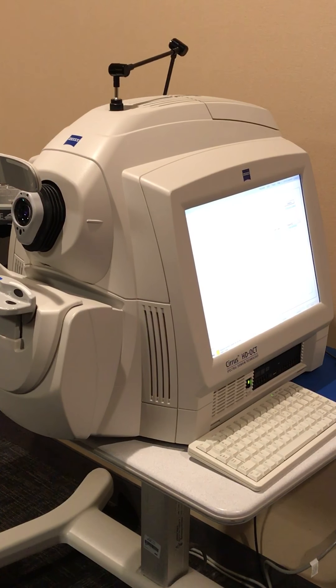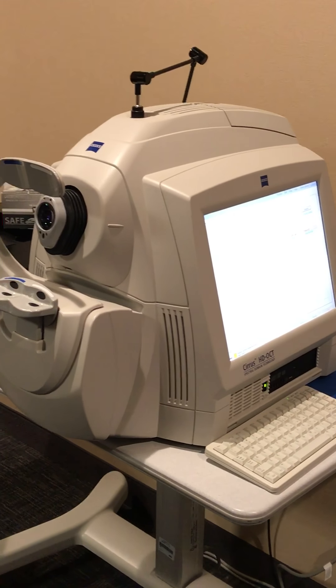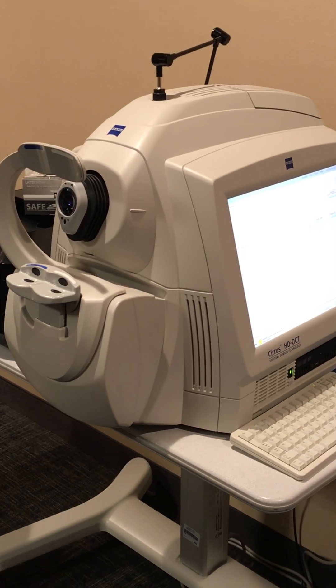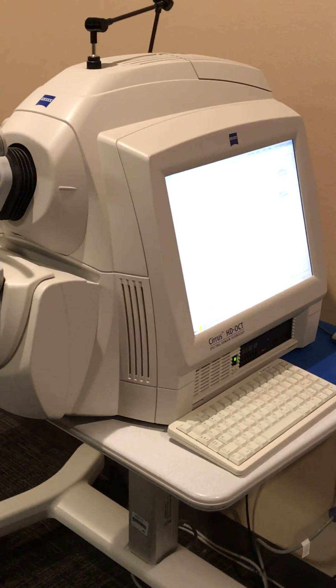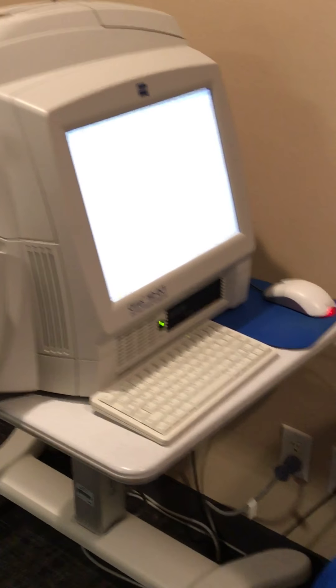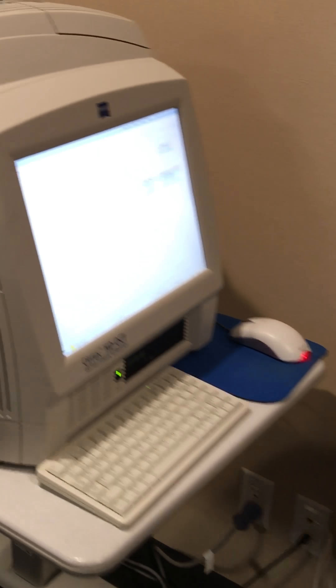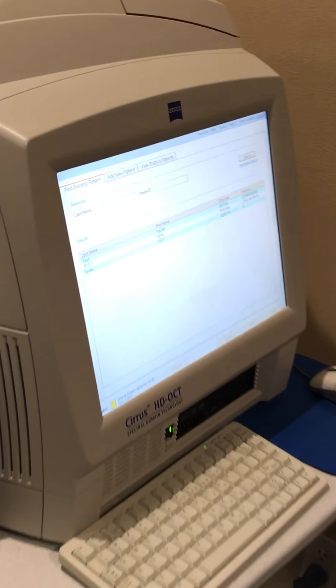This is the Zeiss Cirrus OCT 400. This machine will scan the back of the eyes. We'll look at the patient's optic nerves and their retinas.